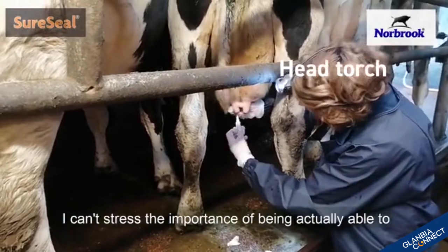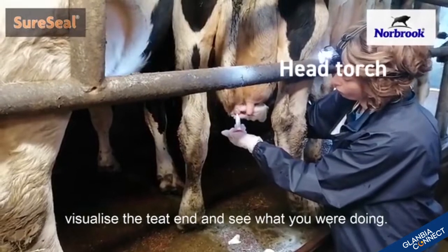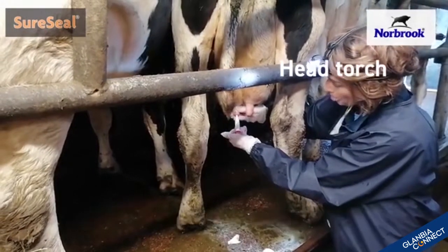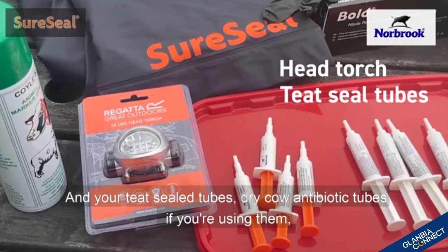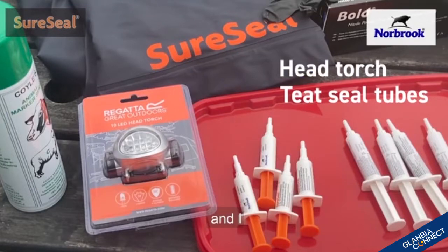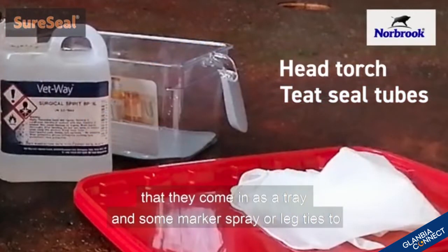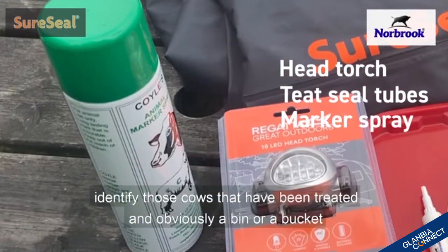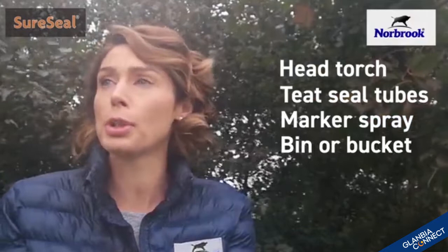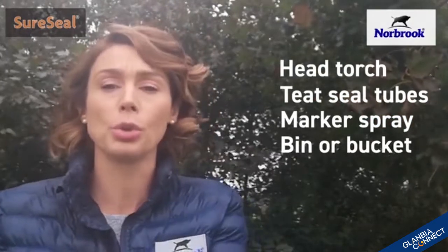A head torch — I can't stress the importance of being actually able to visualise the teat end and see what you are doing. Your teat seal tubes, dry cow antibiotic tubes if you're using them. I like to use the top of the buckets that they come in as a tray. Some marker spray or leg ties to identify those cows that have been treated, and obviously a bin or bucket for all the used tubes and cotton wool.